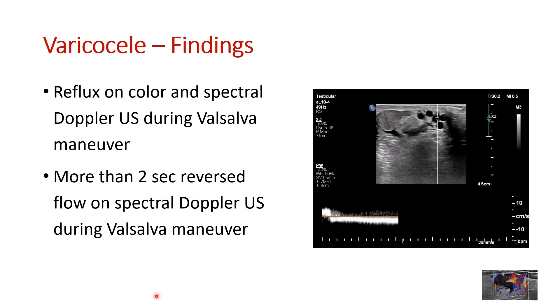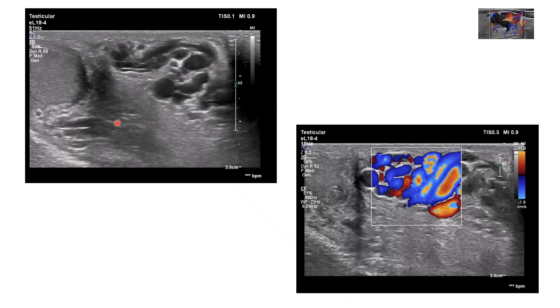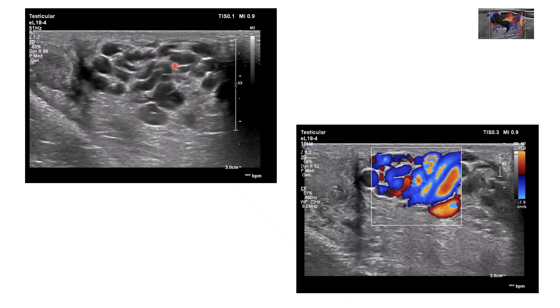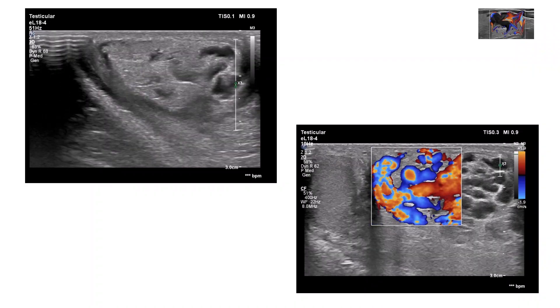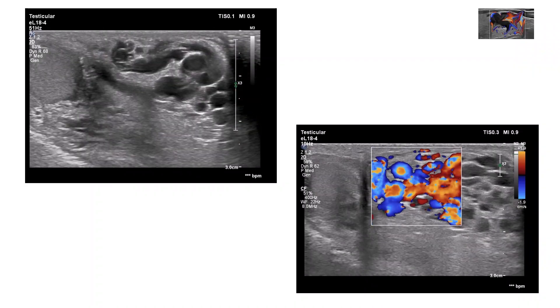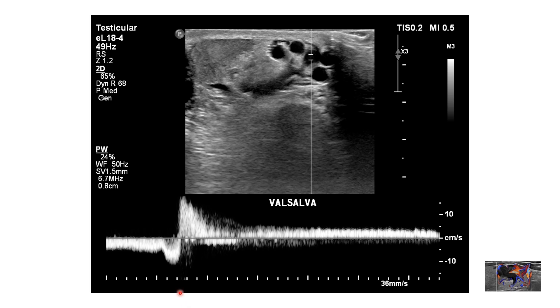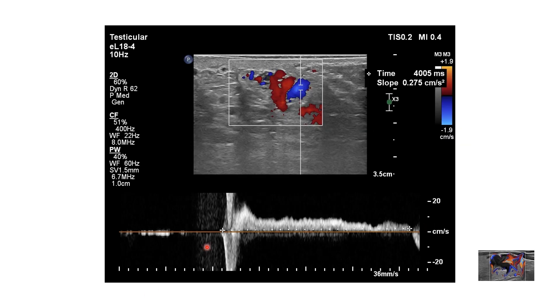During the Valsalva, flow reversal more than 2 seconds should be considered abnormal. You can see the enlarged veins here and the color reflux. This is natural respiration, and you can see the reversal of flow during the Valsalva maneuver lasting 4 seconds, which is abnormal.